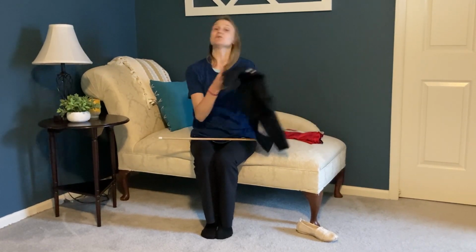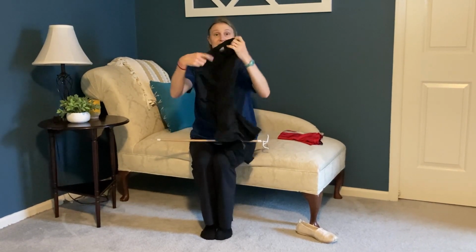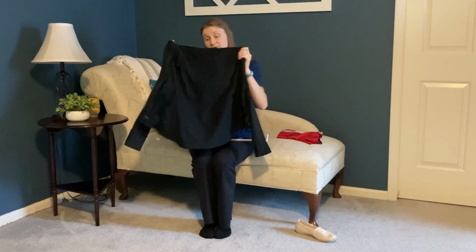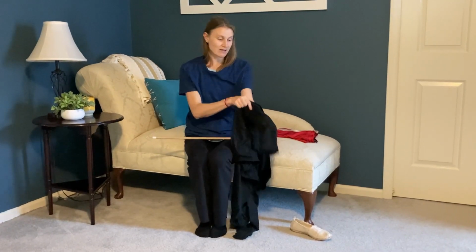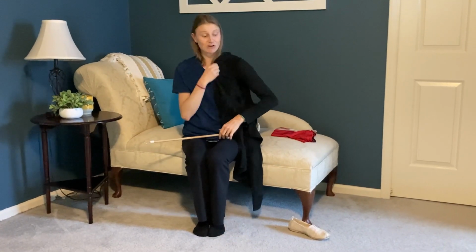You can also use the dressing stick to help with getting jackets or sweaters up and around your shoulders. So if you were putting this jacket or sweater on, you would take the arm that you have the most difficulty getting dressed in first. So in this case, maybe I have some shoulder pain in my left arm. I'm going to put my jacket on this arm.